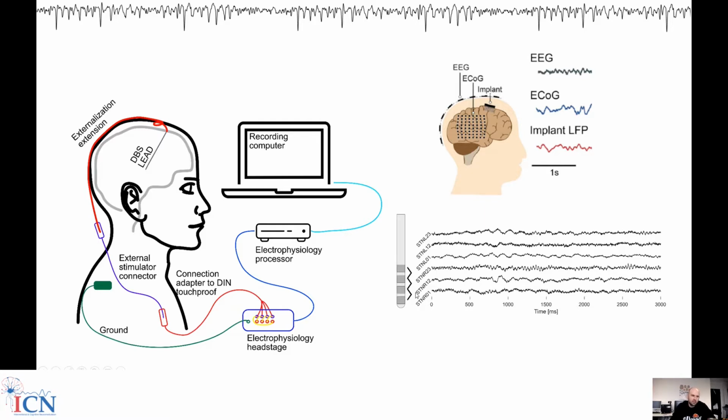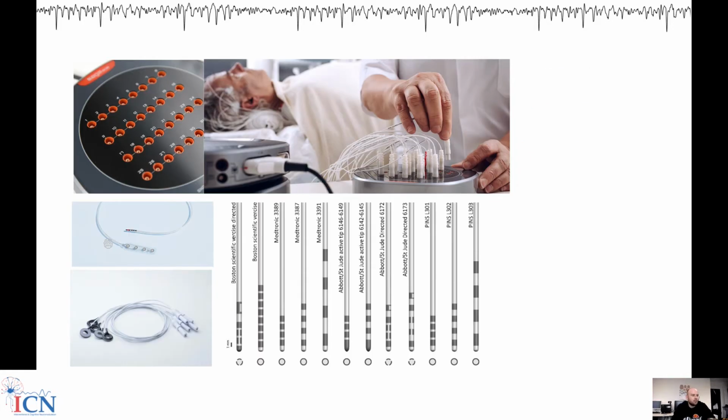And often, you only have one reference. So to get to this stage, there is some manipulation of the data required. And that is even more complicated when we talk about the different kinds of DBS electrodes. Not all electrodes are the same. The previous example was a standard Medtronic electrode that you can see here. It has 4 contacts and it's relatively easy to handle for LFP.